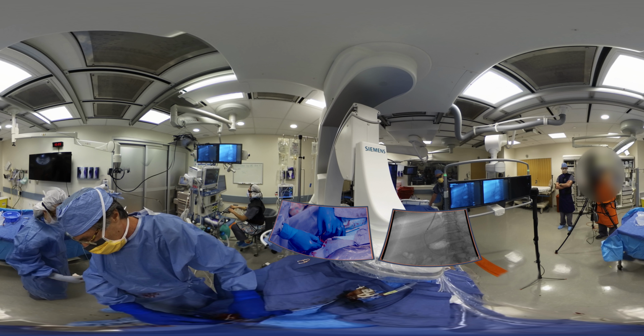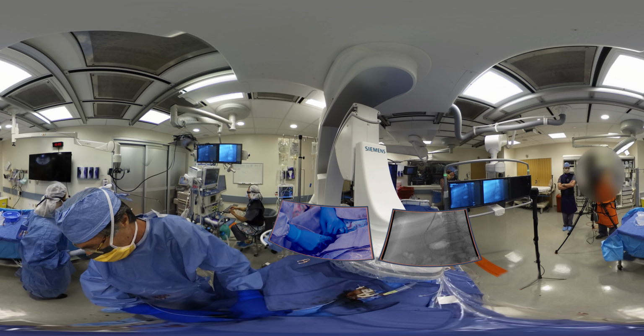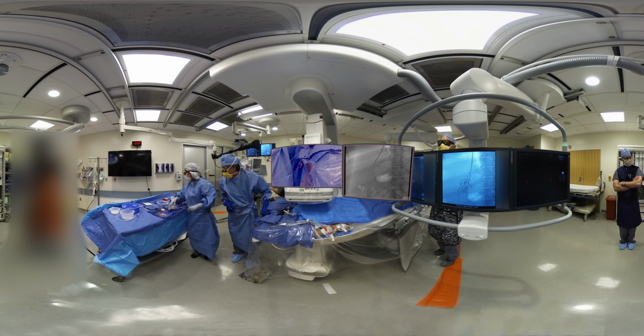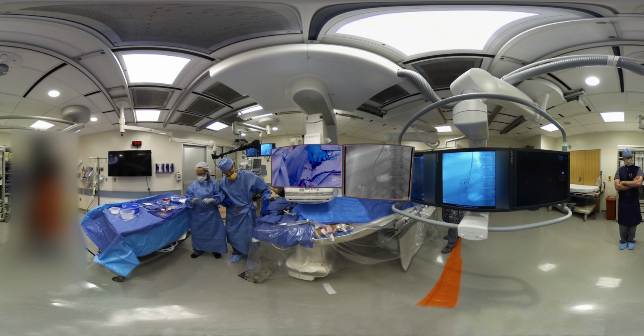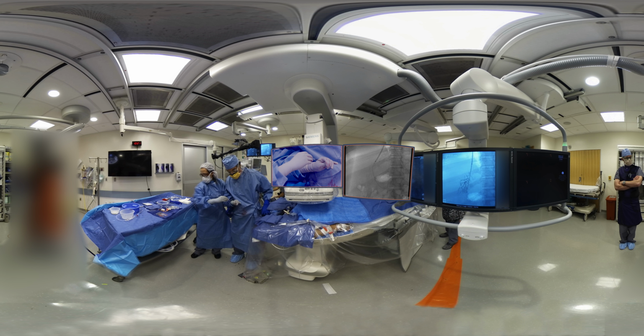Now at this point there may be blood coming out. That's a good sign, because that means that we've got it at or maybe even in the portal vein. We're going to take the black catheter, or we could use the MPB. It's dealer's choice. At this point we're going to thread a catheter into the splenic vein. And keeping that sheath pushed up against it vastly increases the likelihood that this will leap across that little tight spot, won't back up our system into the tract, or even worse, into the hepatic vein.